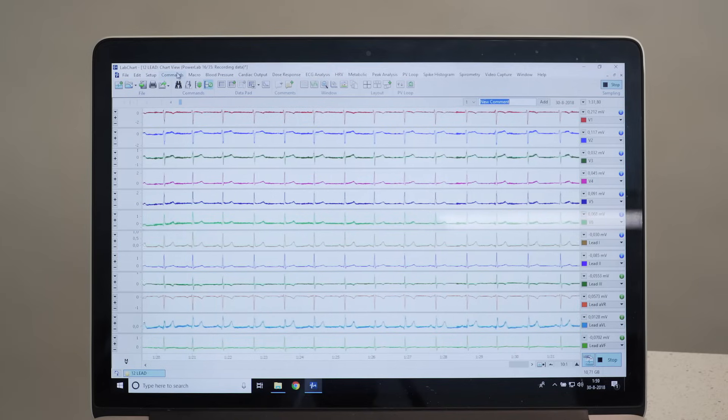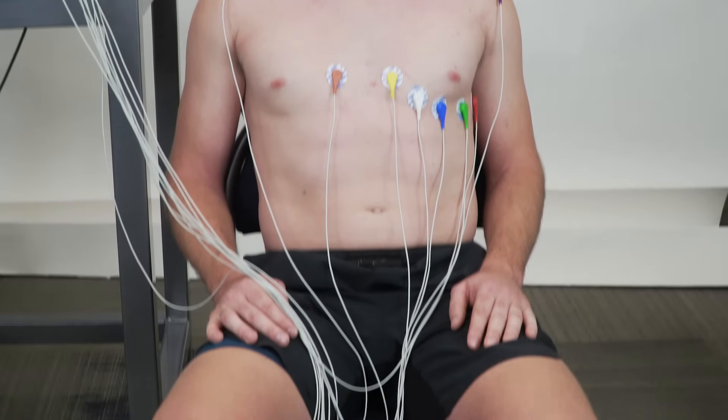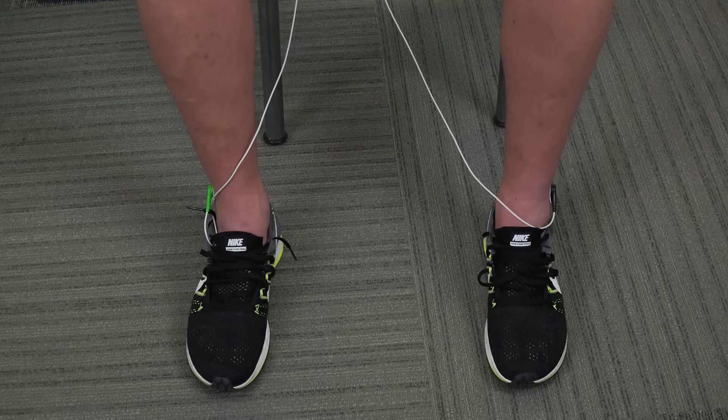An important part of getting really clean ECG data is to have the subject either lying down or sitting very relaxed in a chair, as EMG can cause a lot of noise artifacts in your signal.